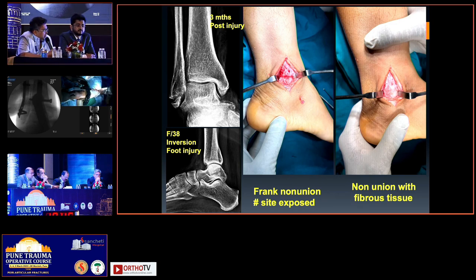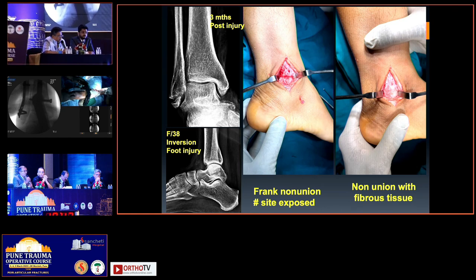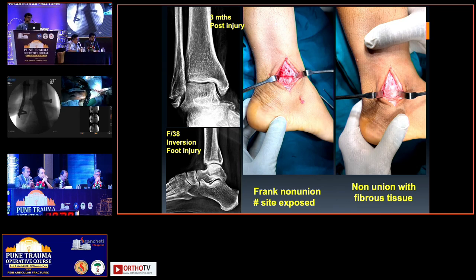This distal tip of fibula fracture, do you think this should render this amount of instability, or is there any associated ligamentous injury at the ankle syndesmosis level also? Yeah. Agreed, sir. Very well said, because this is infrasyndesmotic. Per se, only this injury won't contribute to the instability, because the ATFL attachment is oblique, anterior and proximal. So if this is contributing to the instability, you should just note down in the AP view, the lateral process of talus is not absolutely corresponding to the calcaneum down there. So one should suspect something more if it is becoming symptomatic.